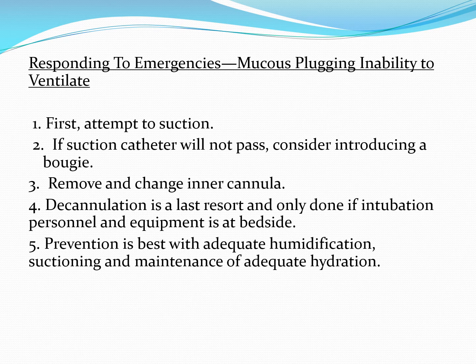There are others, like Portex tubes, where the inner cannula doesn't actually have a flange on it. The flange is part of the tube itself. But Portex tubes are not commonly used. So in all cases, you should strongly consider ensuring that there are extra inner cannulas at the bedside. Decannulation is the last resort, done only if intubation personnel and equipment are at the bedside.